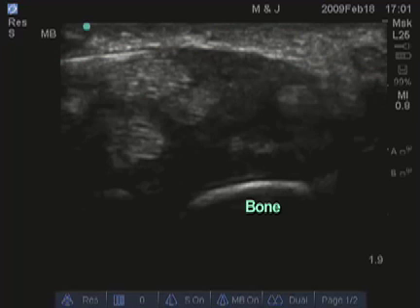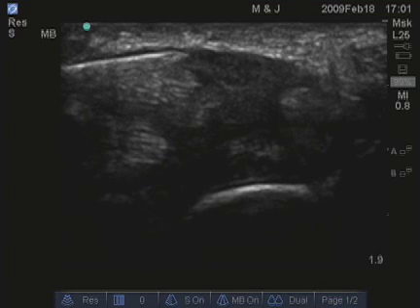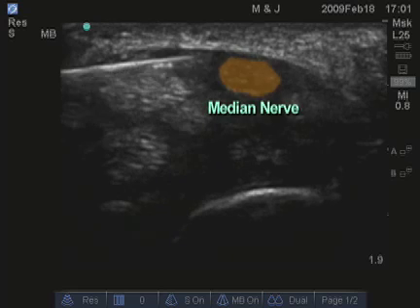This is bone down here. You'll see the needle advanced superficial to the nerve, and fluid, which includes steroids and lidocaine, injected.